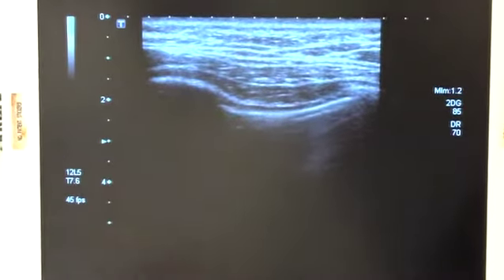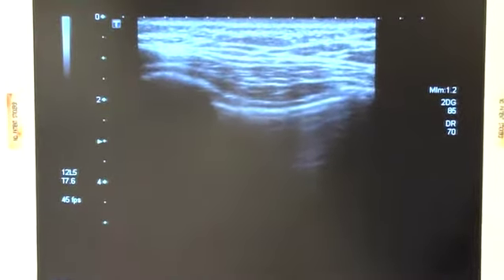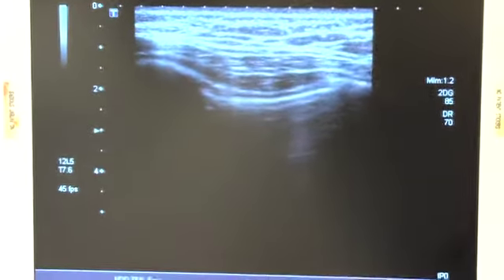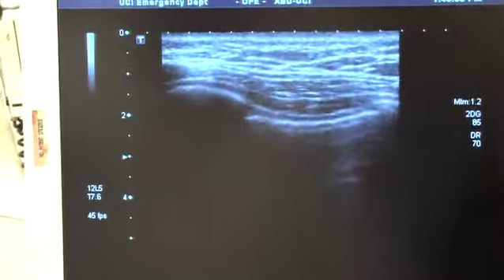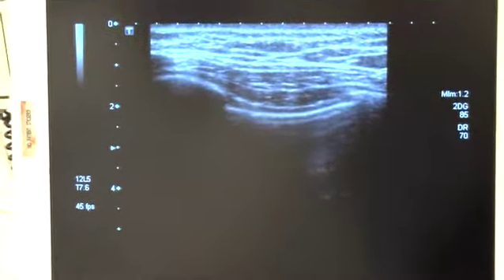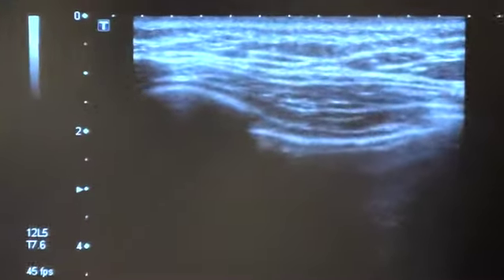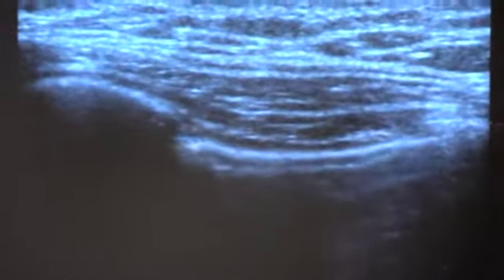What the ultrasound finding we're looking for is a sliding lung line to rule out pneumo. If there is sliding lung, we're going to basically rule out pneumothorax by seeing this ultrasonographic finding. This is a finding that is made by the visceral and parietal pleura rubbing up against each other. So if they're rubbing up against each other, there's no air in between. What we're looking for is this sliding lung.